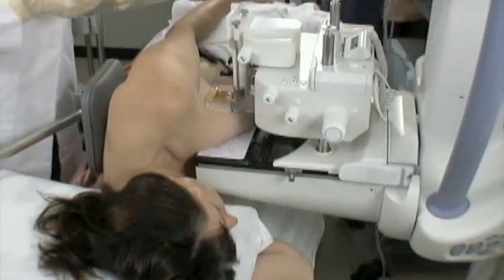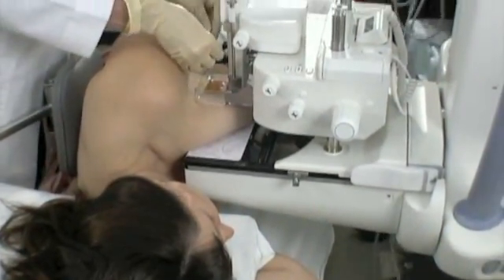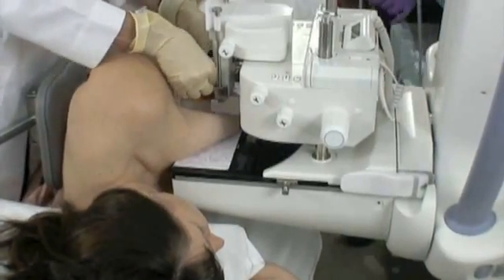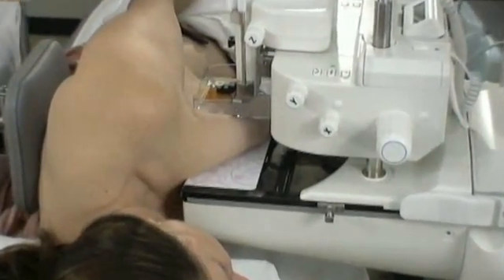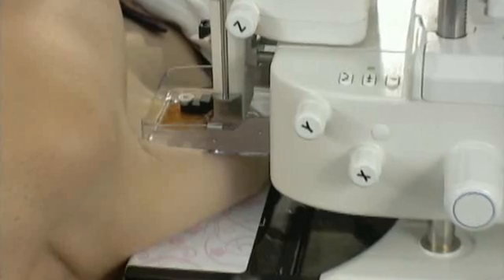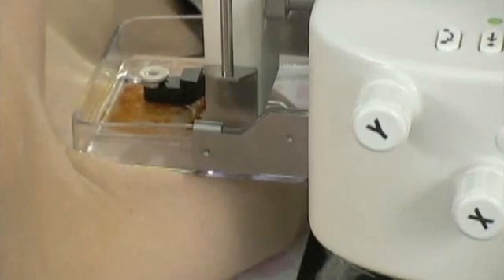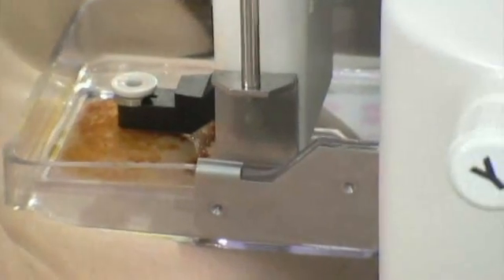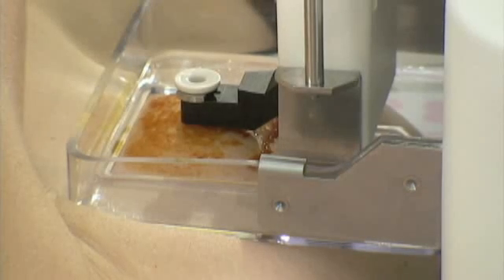We will fire outside of the breast on this case. Each needle manufacturer has a needle guide that comes with the kit. The needle guide is sterile and is placed on the machine at the time of the biopsy. We have zeroed our target so the calcifications are right below the needle guide. It's very important to confirm the position of the calcifications on the image, because every once in a while someone will forget to zero the target and end up on the last target.